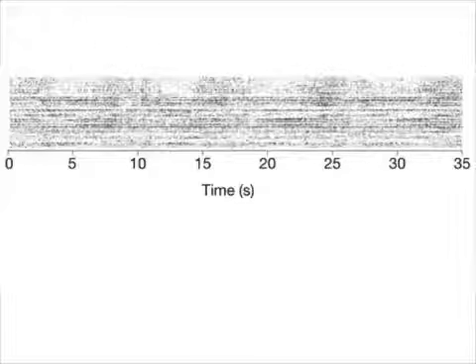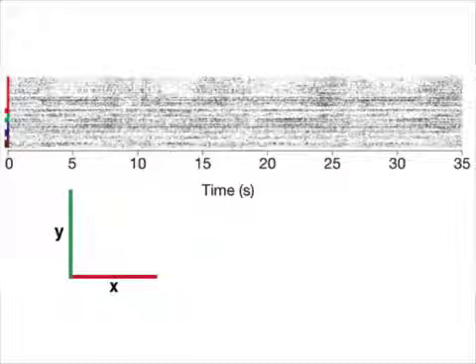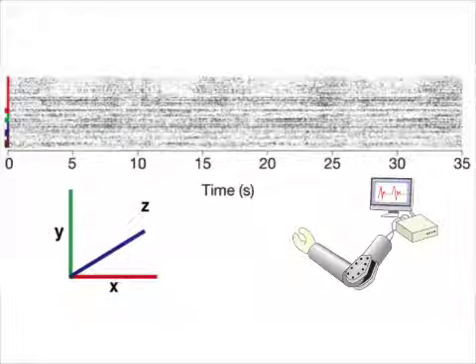And in this dataset, the individual rows are grouped by the major tuning components, that is, the 4 dimensions of the experimental space, indicated by the color bars. Red for the x-axis, green for the y-axis, blue for the z-axis, and brown for the gripper, the 4th dimension in this setup.